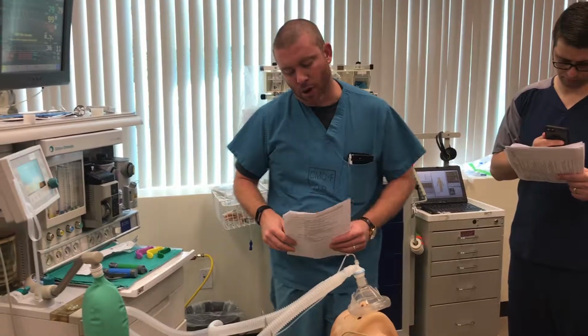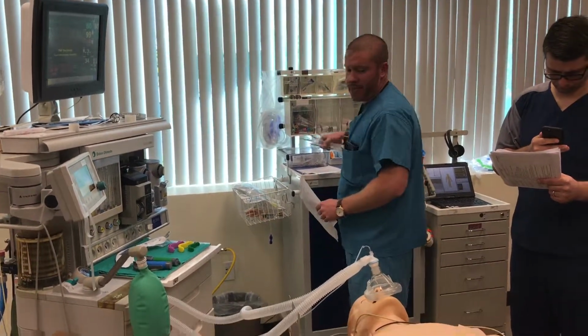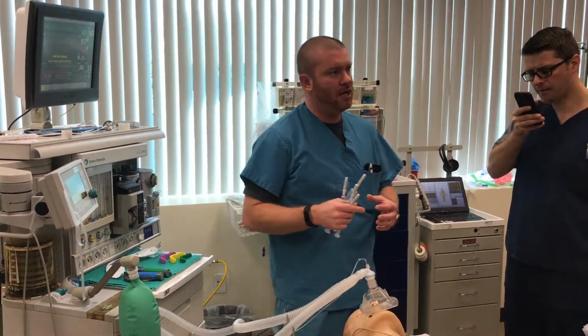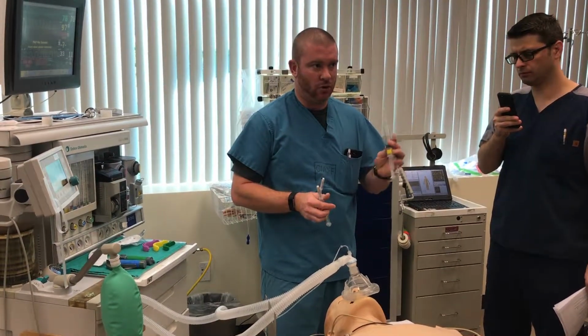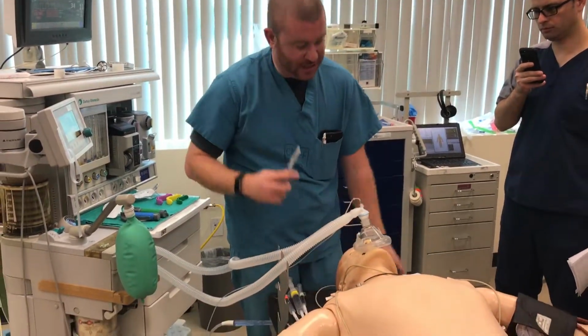My drugs attached to my manifold. 3 drugs if we had a manifold. We're not going to have it here, but if you go to places like CRMC, we have a drug manifold that can connect 2 or even 3 different drugs. Typically 3. You can have our lidocaine, our propofol, or muscle relaxants. We're going to be using succinylcholine. Still need to give my narcotic, right?